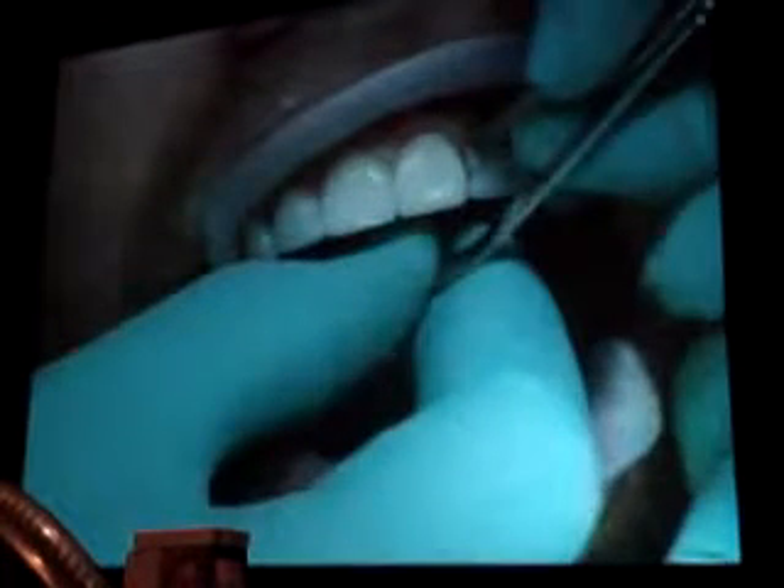And you'll see what we can show you afterwards — then loosen this blade and wrap it around. See how that wrap goes. You want to wrap it around, make contact, go ahead and smooth that out. There's a little weight there. Go ahead and take the other side, go in here, loosen this up, wrap it around, and smooth that down.